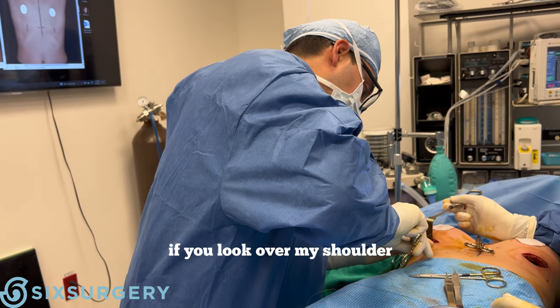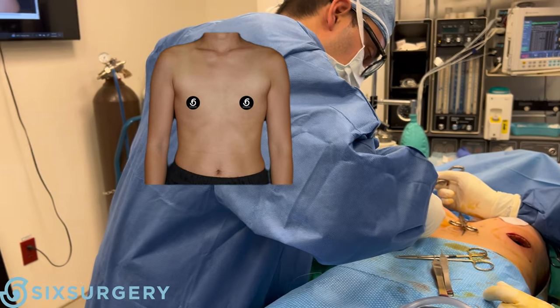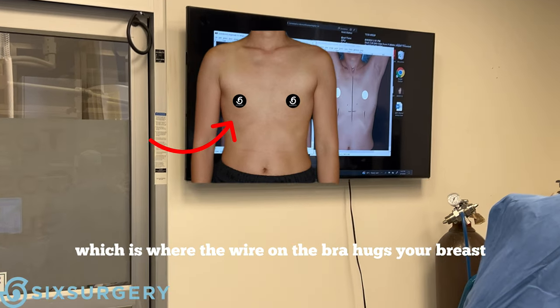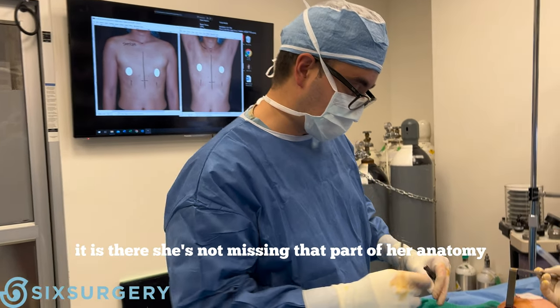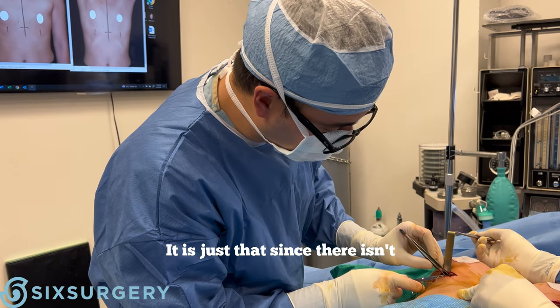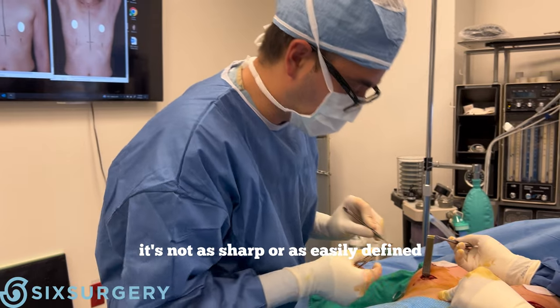If you look over my shoulder as I'm doing this carefully, you can see that in the pre-op photo, the inframammary fold — the fold at the bottom of the breast, which is where the wire on the bra hugs your breast — that part is not very well developed. It is there; she's not missing that part of her anatomy. It's just that since there isn't the amount of breast tissue that she'd like to have, it's not as sharp or as easily defined.